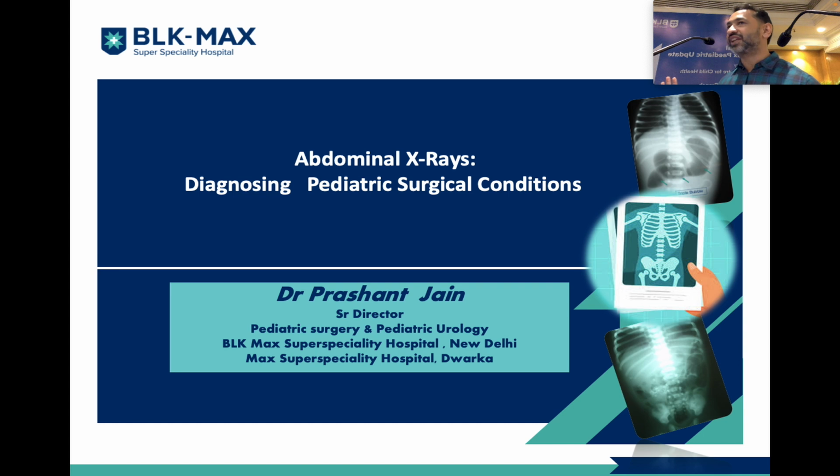And this is a session, I hope you will find it interesting because I'm going to talk about some very important X-ray findings which help us in making a diagnosis in various pediatric surgical conditions.